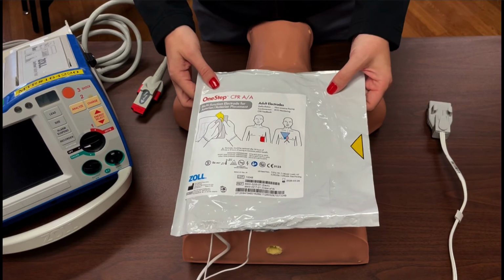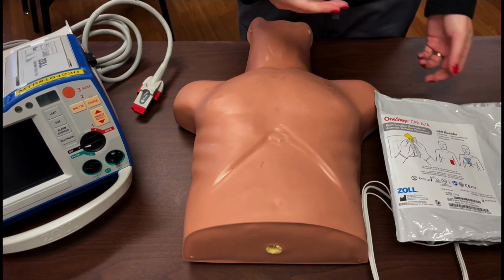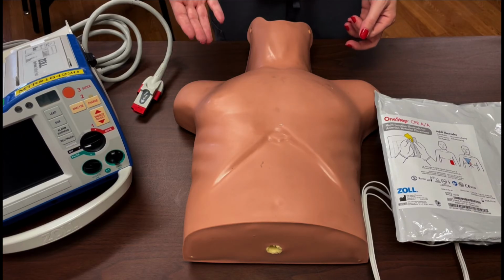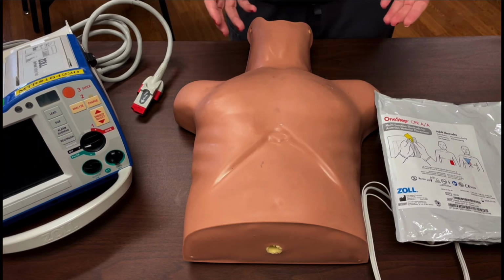So the first thing you're going to do when you're going to put the pads on is to take a look at your patient's chest. The patient's chest should be dry, free from copious amounts of hair, which means you may need to use a razor to take some of the hair off if you have time. And if CHG has recently been applied, then you need to let it dry completely.